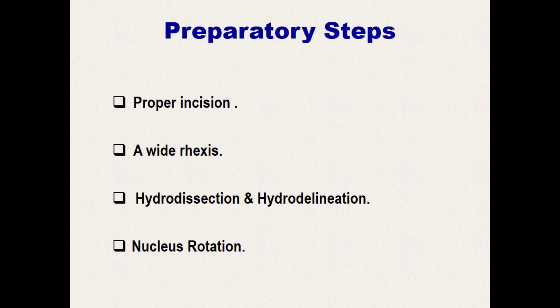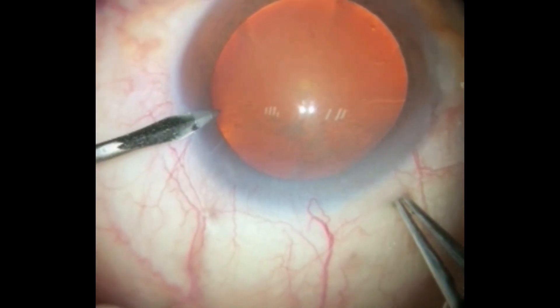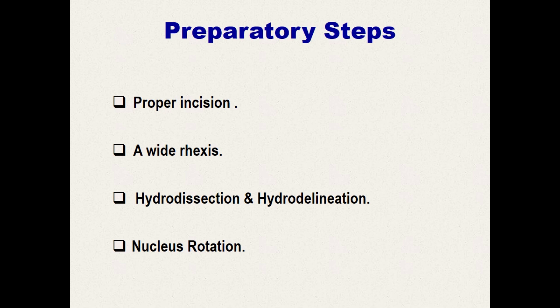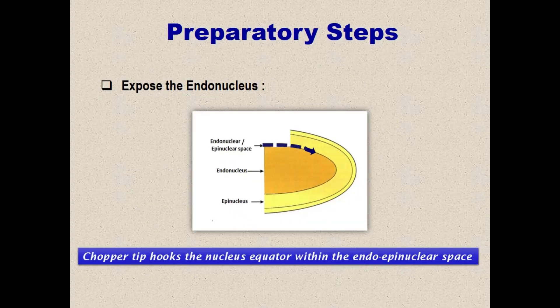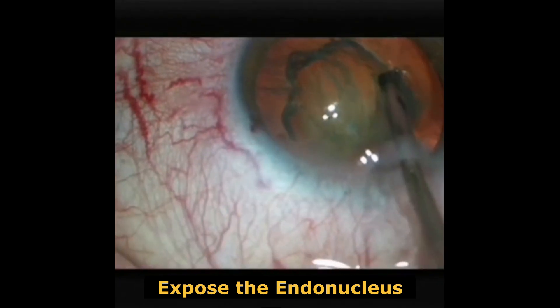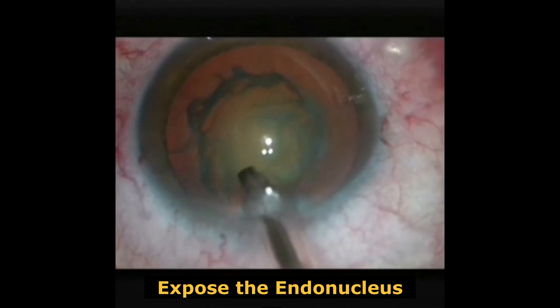As faco is steps built on each other, the preparatory steps are essential. A relatively non-leaky incision, especially the chopper's sideport, helps maintain a stable anterior chamber during the chopper's maneuverability. Intend a slightly larger anterior capsule rhexis, especially in dense large nuclei, to facilitate peripheral chopper placement. Hydrodissection and nucleus rotation should be performed efficiently, and for beginners, hydrodelineation helps identification of the endonucleus equator. Shave the anterior cortex and the anterior epinucleus within the confines of the capsule rhexis to expose the target — the endonucleus. You can then estimate the actual volume of the endonucleus and the amount of separation between the endonucleus and the surrounding capsular bag.